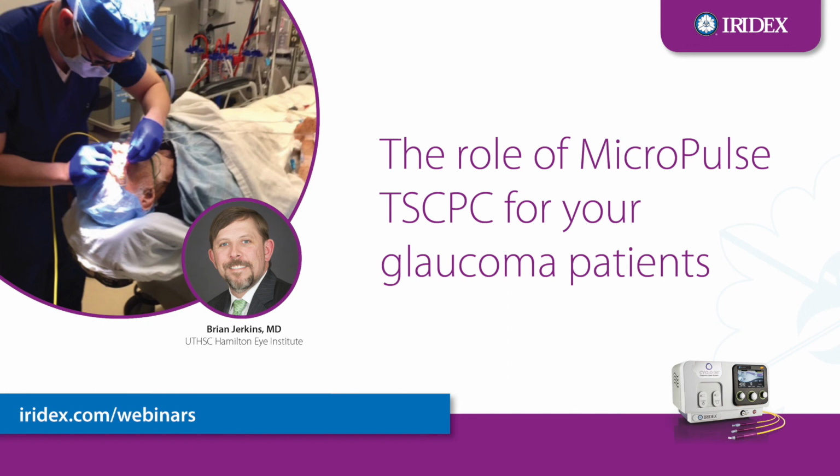So I know that at AGS this year, 2019, there was a poster concerning transient mydriasis. Have you experienced this phenomenon or complication in any of your patients? I would say I probably have. I do think some people do have a little bit of transient mydriasis, just like you get a patient with some rebound inflammation. So I do think you're treating a significant amount of uveal tissue there, that you are getting some transient mydriasis, but I haven't seen it be clinically significant or anything that's been long-term. Okay. And if anybody's interested, the poster was by Dr. Sean Lin of UCSF in San Francisco, and it was presented at the AGS meeting this year, 2019, if you want to look it up.